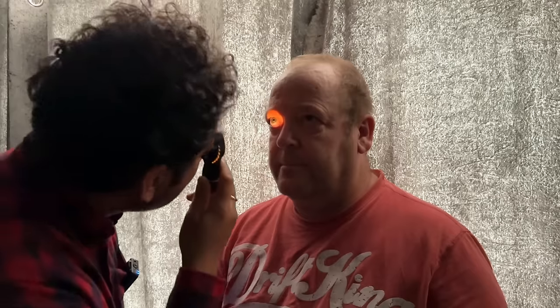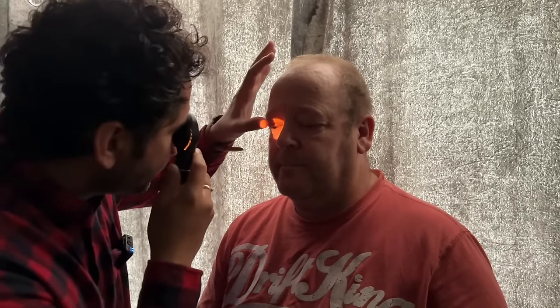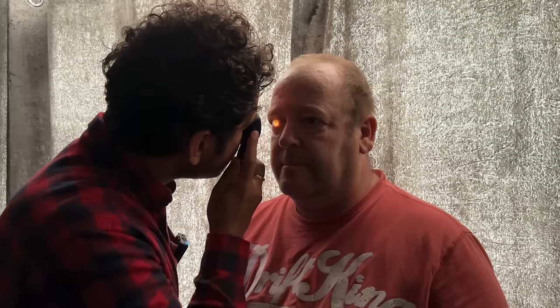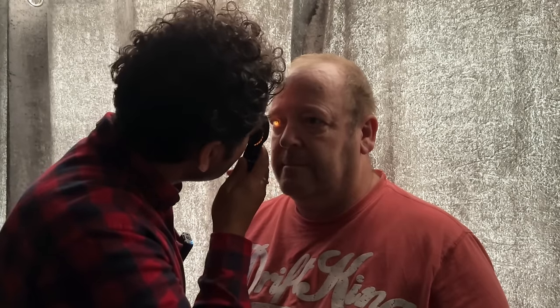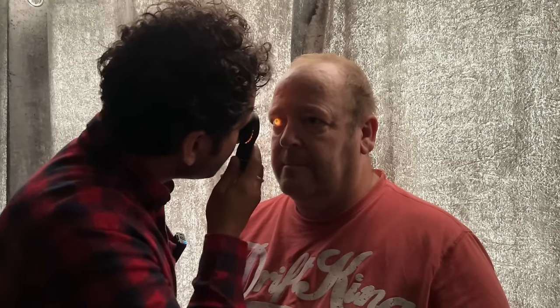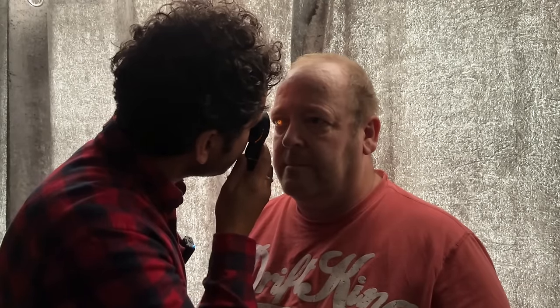Look up and look down as I lift the lid, and straight ahead. Now we can judge whether there's any sclerosis of the crystalline lens as we come closer and focus on the fundus, and have a nice crisp image. My estimation: we have a clear crystalline lens. And now the first thing I'm doing, coming from the lateral side, is focusing on the optic nerve and just making some observations.